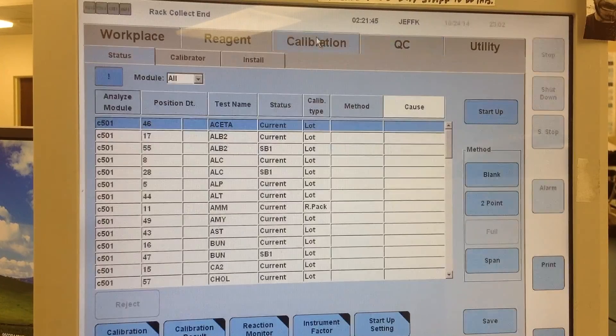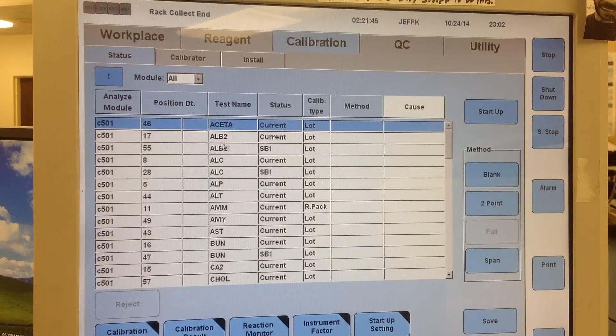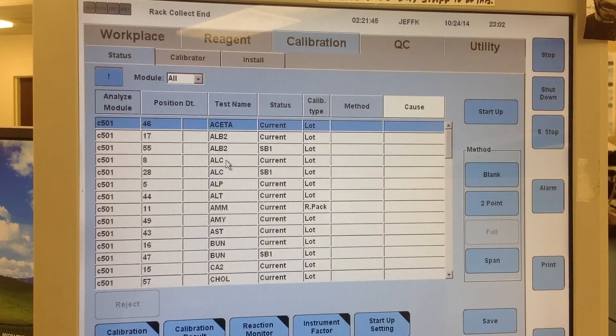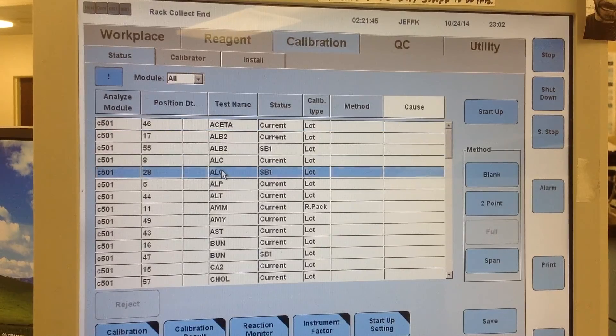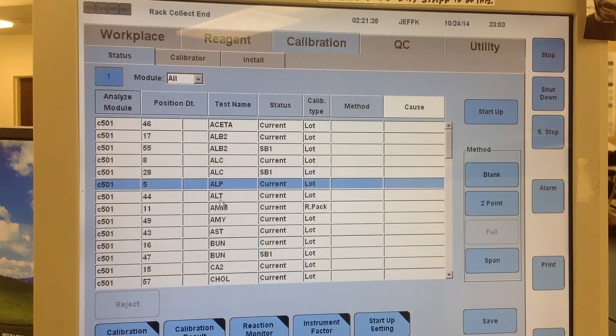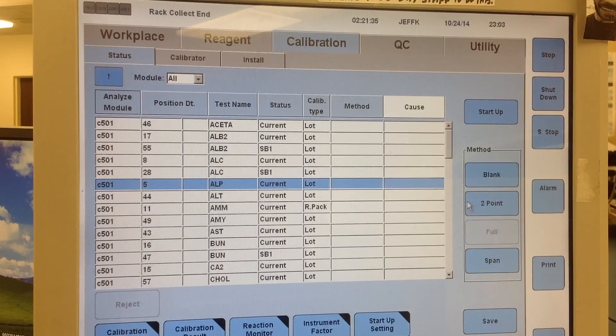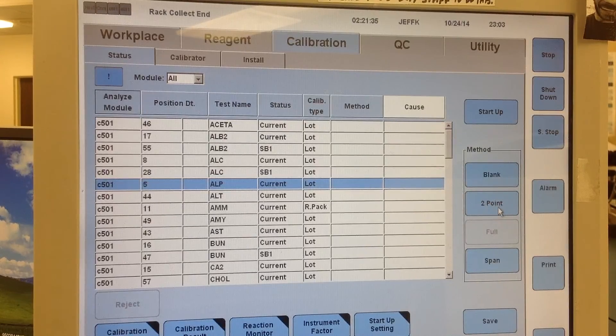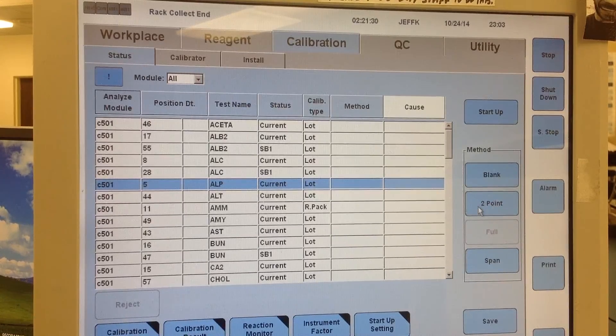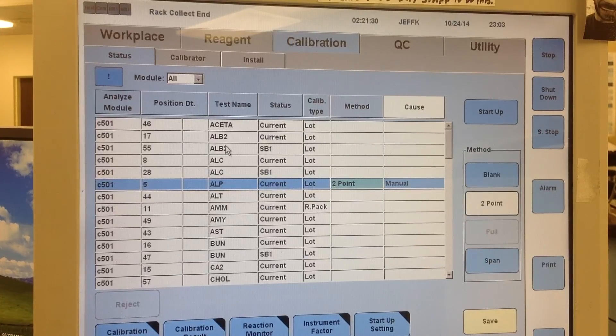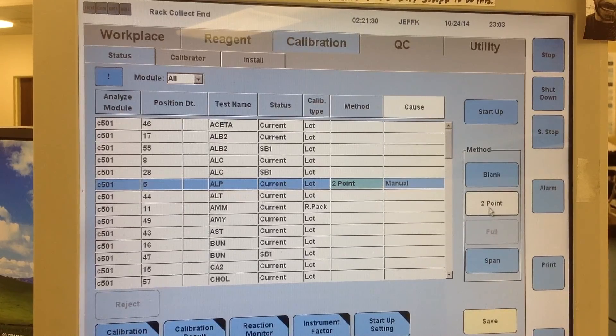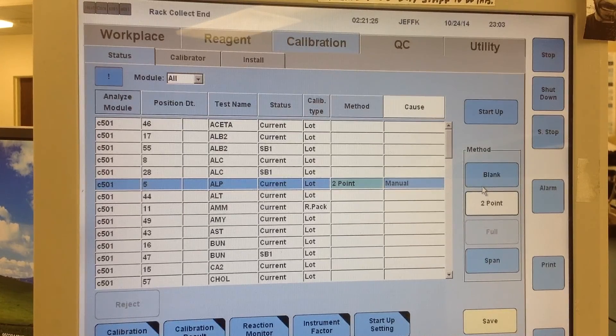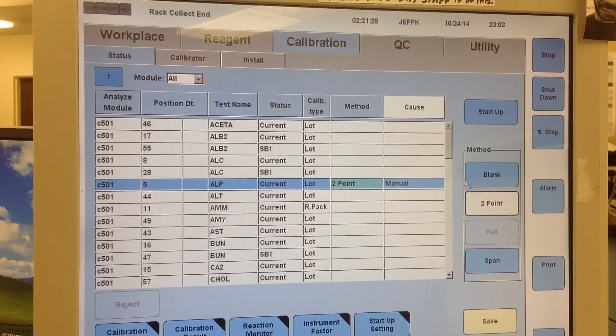Calibrations. Going to the calibration tab is very similar. You just find the test that you want to order a calibration on, and then you want to order, for ALP, you want to order 2 point. So just depending on what the test is, will determine which one of blank, 2 point, or full you have to order.